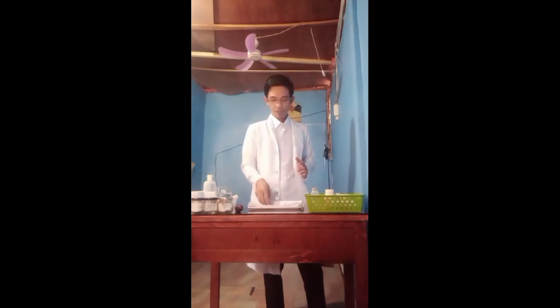So I'm already changing it into a normal syringe, the normal gauge of the tuberculin syringe. Next, for a multi-dose vial, make a label that includes the date of mixing, the concentration of medication per milliliter, and your initials, to ensure future doses are properly prepared. So next is to prepare the parenteral administration.